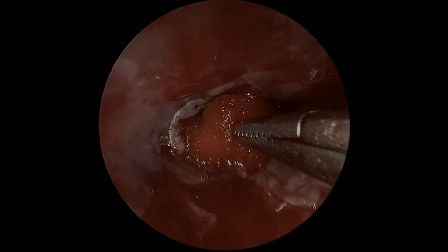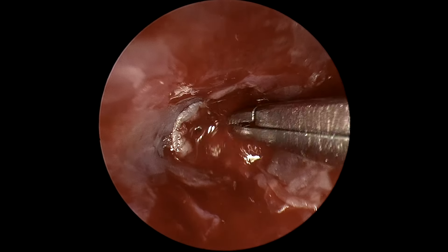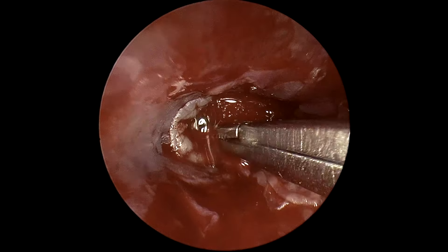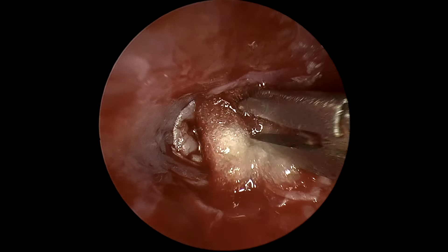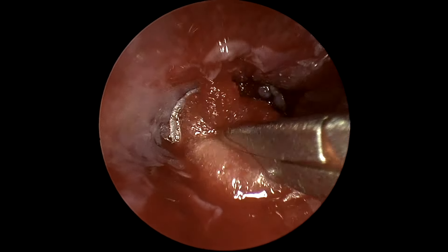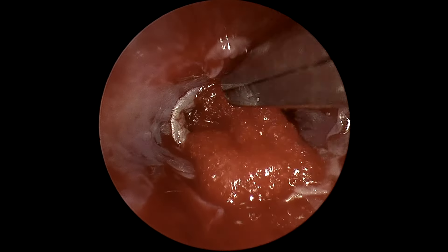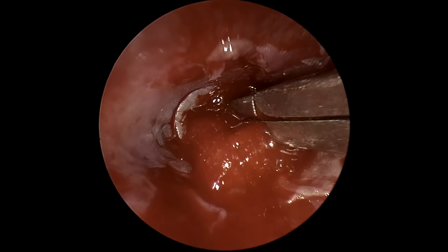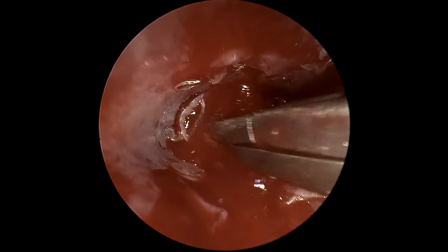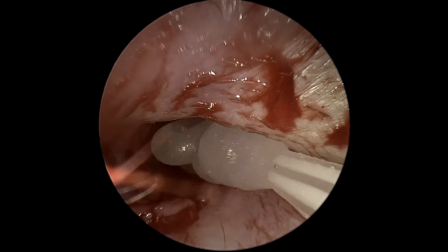Several pieces of gel foam are placed in the center to keep the graft in place. Bacitracin is then placed in the ear canal.